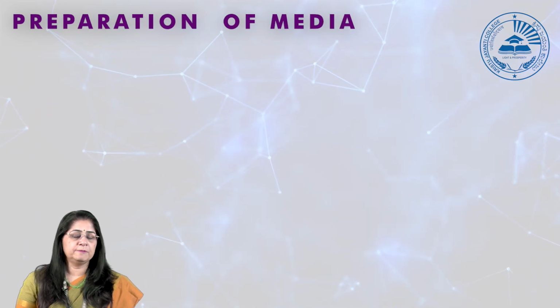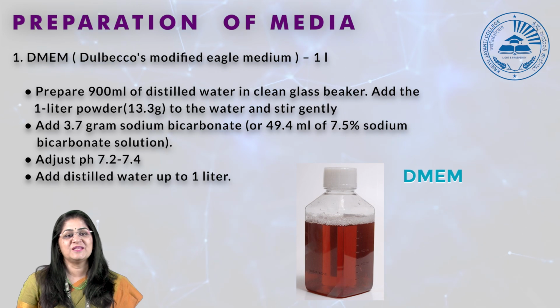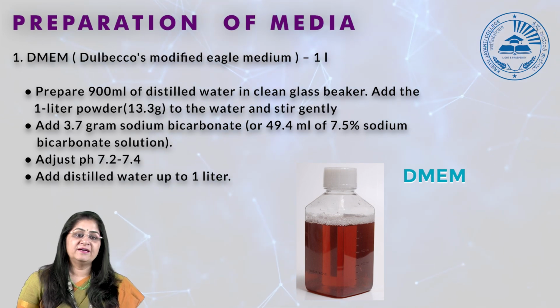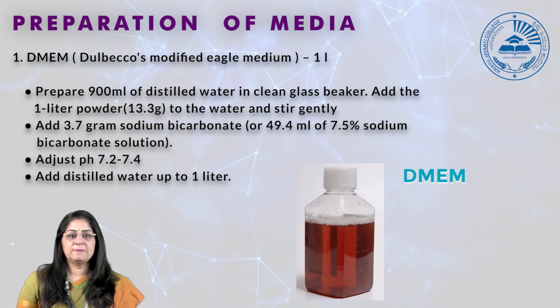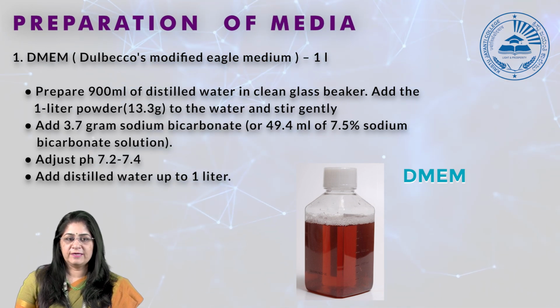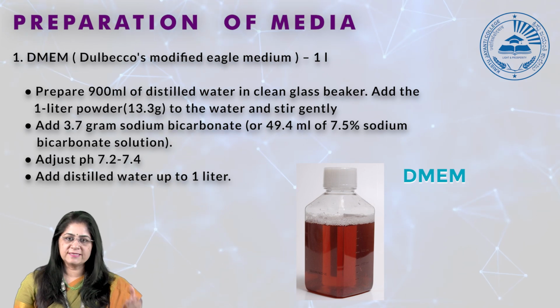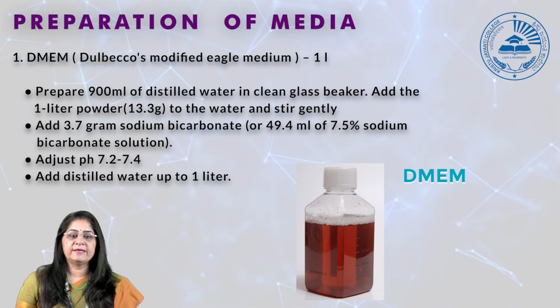Now coming to the preparation of media. Let us take two important media which are the most popular: DMEM, Dulbecco's Modified Eagle Medium. Suppose you want to prepare 1 liter. This also comes as a readily constituted liquid medium, or you get to buy the powder.